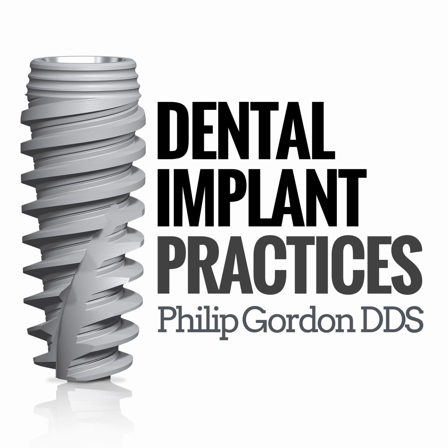The analog technology that we've had for the last 2,000 years is finally being replaced by digital. And I think it's great because not only is it an easier workflow, but it's also more accurate. You don't get the distortions that you get with dental materials like PVS and alginate and stone and plaster and plastics, and everything changes dimension as it cures. With digital technology, you have much greater accuracy because you're not working with all these different materials and hoping that the expansion of one will counteract the reduction of the other one, and vice versa.